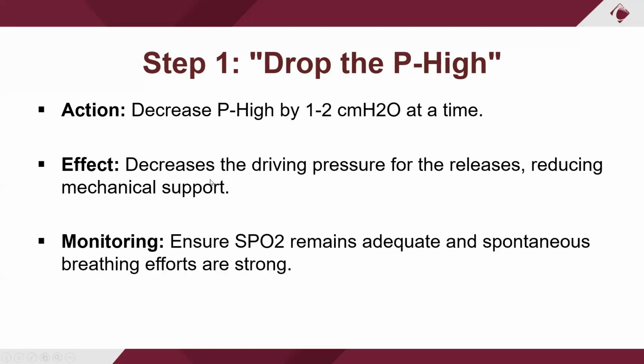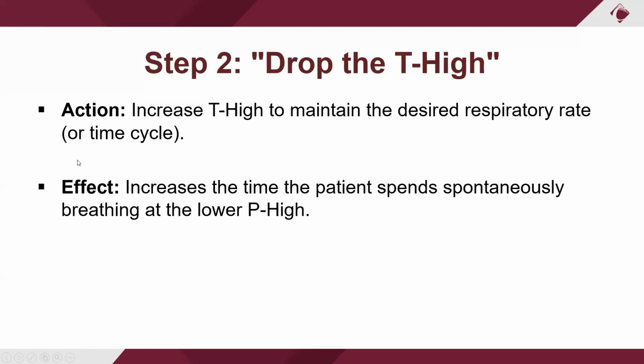And again, the effect is you're trying to decrease that driving pressure for the releases, reducing mechanical support. You're getting more spontaneous effort. And that's what we're trying to look at here. Again, take the time high out and you're going to stretch that out.